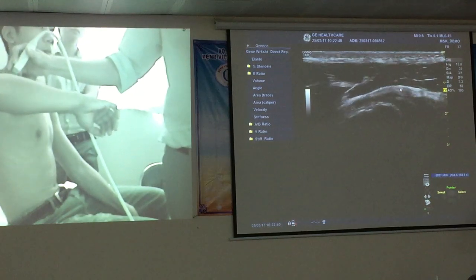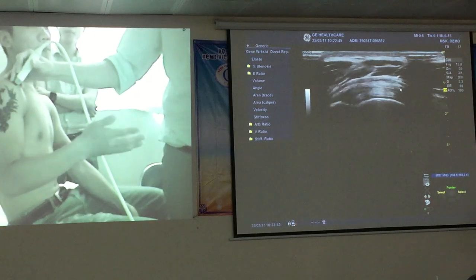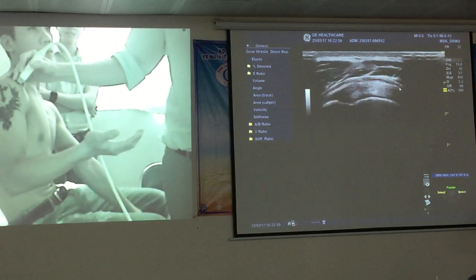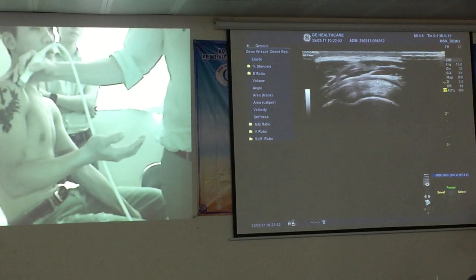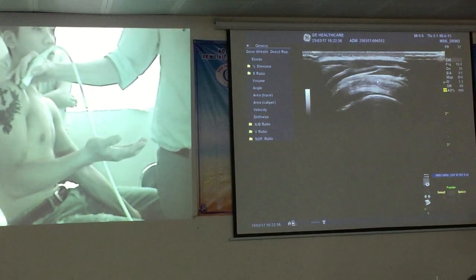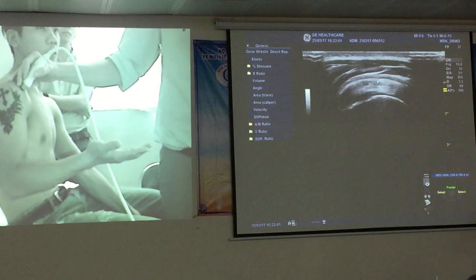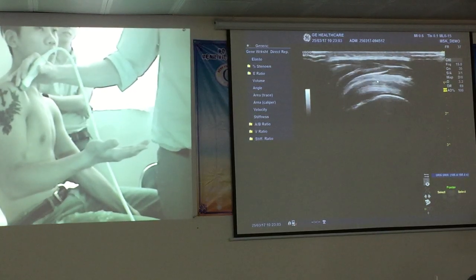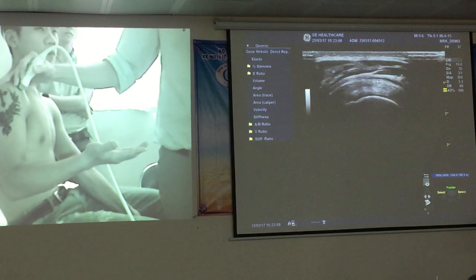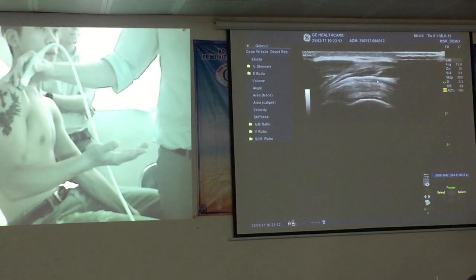And at this point, I would ask the patient, is that sore when you bring your arm up? Em có thấy đau khi mà em giãn cái cánh tay đây không? So remember that the bursa is a normal structure. It's there as a protective mechanism, so they are normal. It's only when they start to get thick and filled with fluid that they don't function properly. So a little bit of fluid is okay. Một ít dịch ở trong bao bọc dịch này thì là sinh lý, còn nếu có dịch nhiều hơn như vậy bao bọc dịch bị hạn chế vận động thì lúc đó là có bệnh lý.